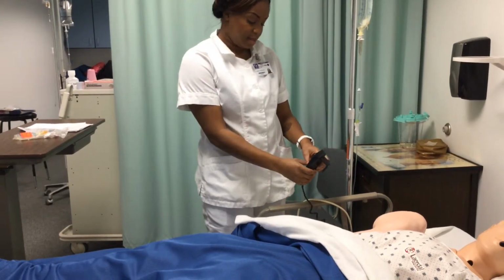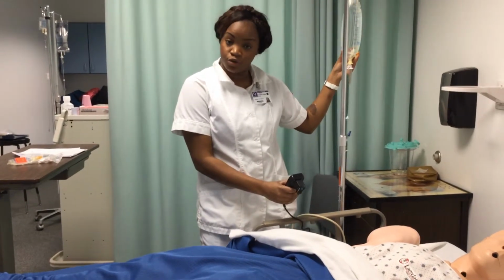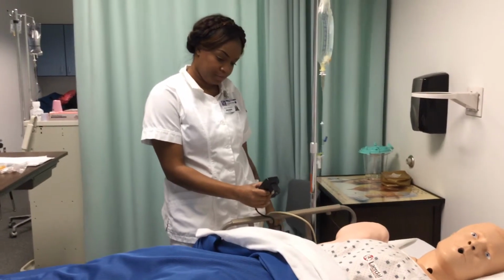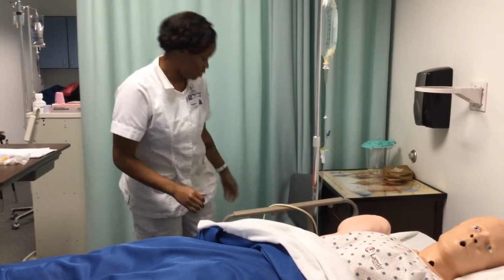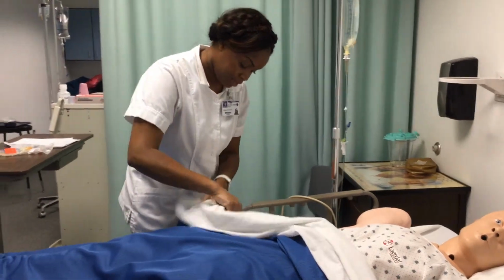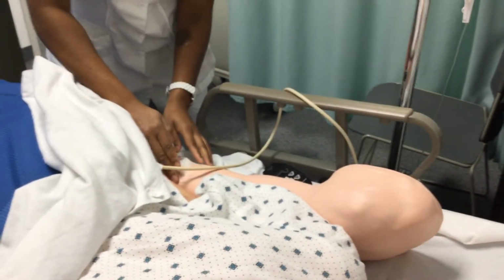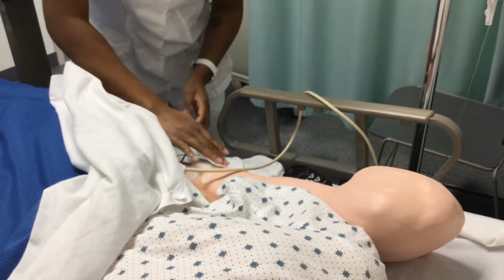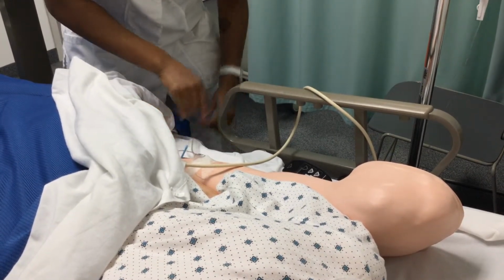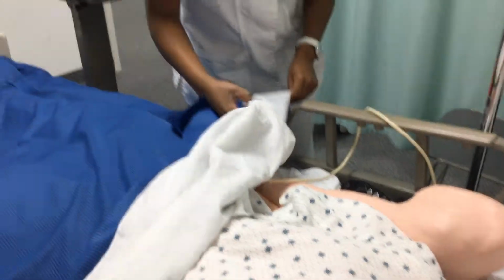Patient has a primary line going of normal saline. Gentamicin is compatible with the normal saline, so I can go ahead and connect my secondary to the Y site here. Sanitize my hands again. I'm just going to go ahead and inspect the patient's IV site. She has a continuous that's going. It's flowing good. There's no signs of infiltration or phlebitis. Do you have any tenderness? No. There's no tenderness. It's going in and it's hooked up to the primary here. Okay.